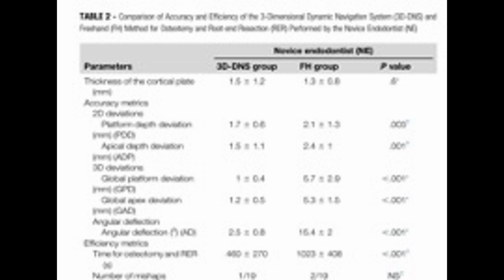While the number of mishaps showed no difference between the experienced endodontists from the 3D group and the freehand group of experienced endodontists, or even between the 2 groups of novice endodontists who used 3D or used the freehand technique.